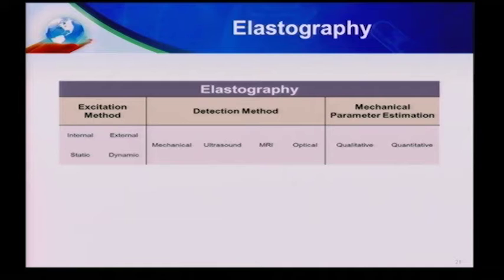So we look at elastography. As I mentioned, essentially you apply a force, so you have an excitation method, and then you have a detection method. For excitation, you can have a static push, for example, or a jet of air compression, or you can use the cardiac cycle with blood pressure change, but those are relatively too slow. So what we decided on is dynamic excitation, what we call acoustic radiation force. Essentially, we just apply ultrasound force and push at kilohertz or several hundred hertz.